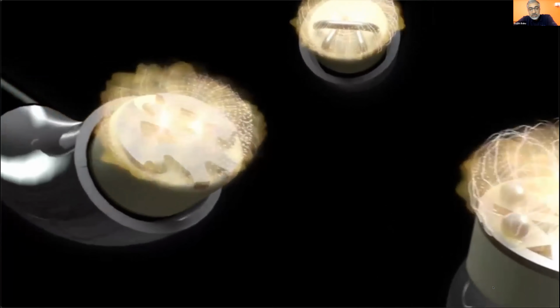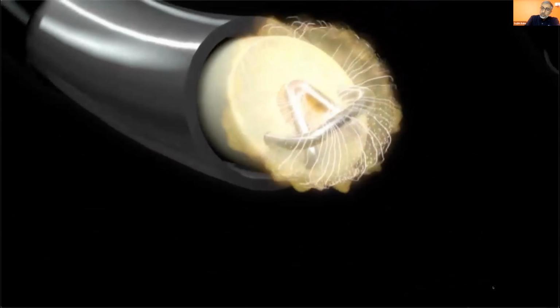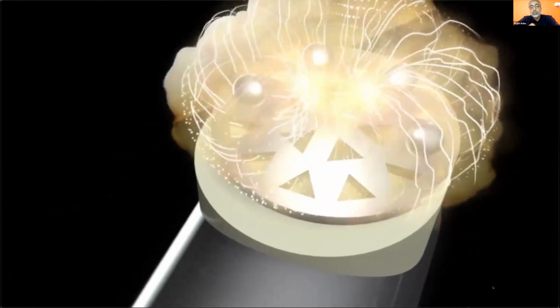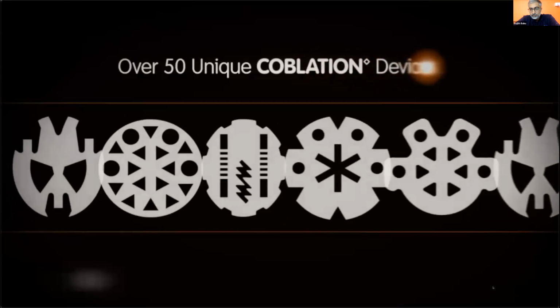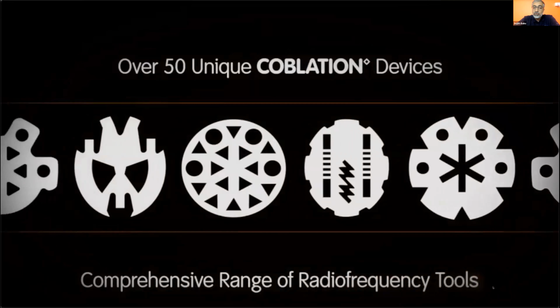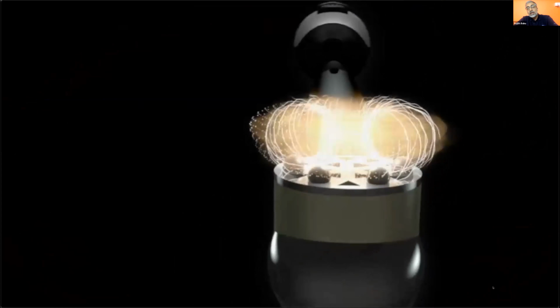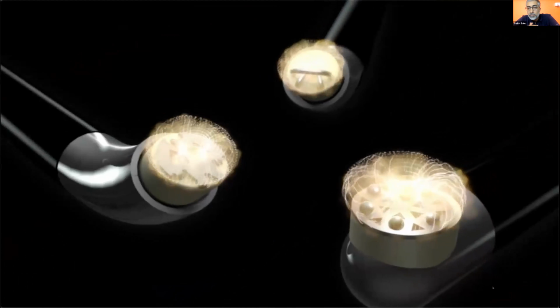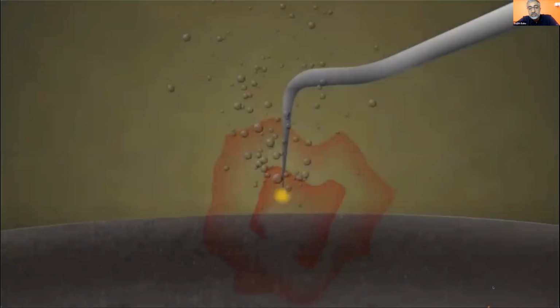There are various wands available, each with its own advantages and cutting tools. The best advantage of this tool is that it does not produce too much heat energy. It's mainly a chemical reaction that cuts the tissue. It has been used for a long time in ENT surgeries, especially tonsillectomies, adenoidectomies, etc. I've not heard of it being used in orthopedic surgery, but it is said to be used, and when I discussed with colleagues in orthopedics, they said it is.